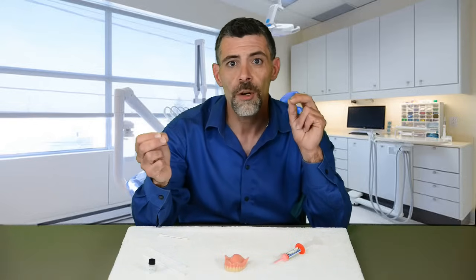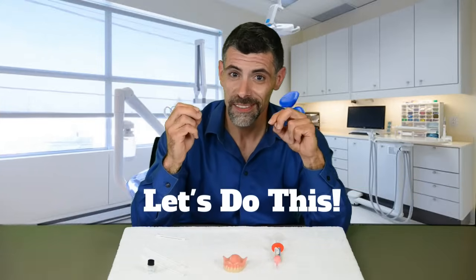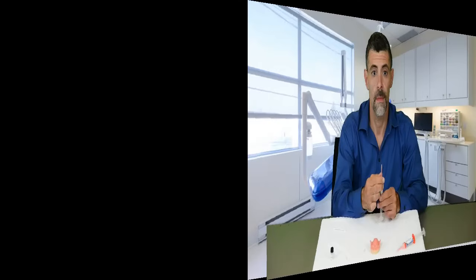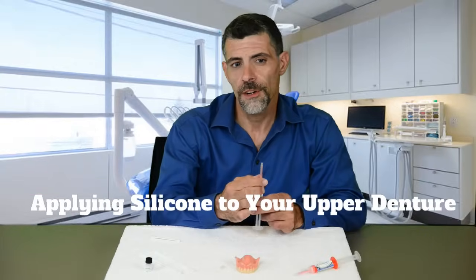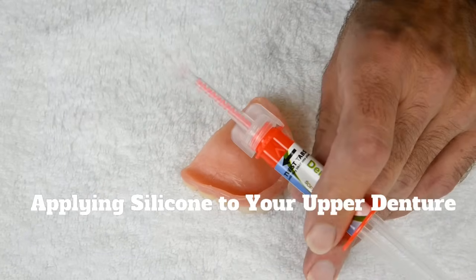You do not want the silicone to start setting up outside of your mouth or it will not spread evenly on your palate, resulting in a poor fit. Now let me prep my denture so that we can do this together. First, activate the silicone applicator — twist the clear wing tabs in the direction of the black arrow until you hear and feel it snap into place.